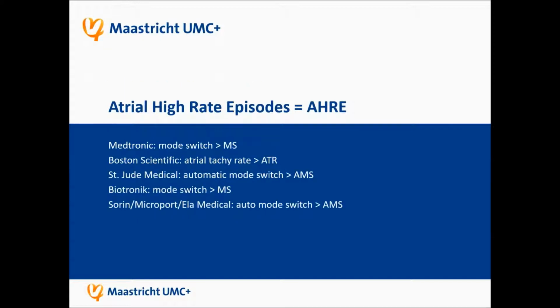Well, first, a very short overview: atrial high rate episodes. That stands for AHRE. And the different manufacturers use, most of the time, mode switch algorithms for the counters, and every manufacturer has a different name or different abbreviation for this. So I put those here for you to see.